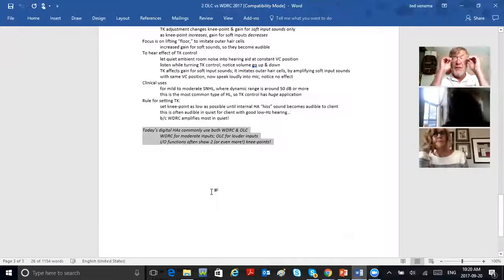The way it used to be, you'd have to choose. I remember the days. It wasn't all that long ago. I worked at Unitron Hearing Aids, where Ms. Lynn Royer works a lot too. And I remember I'd have to choose the hearing aid. Okay, Ted, are you going to use WDRC? Okay, the client's got a mild to moderate loss. Yep, order WDRC. What type? Input compression. Okay, send in the order form. If I sent in the wrong order form, shoot, I had to change the whole thing again.